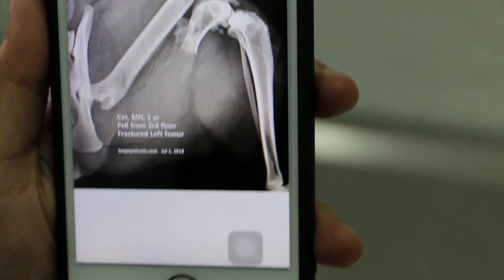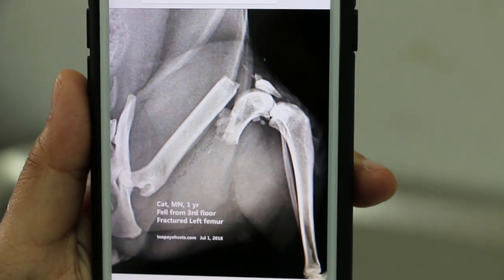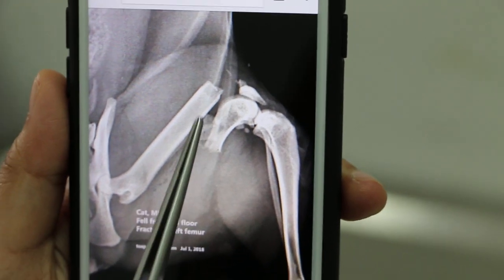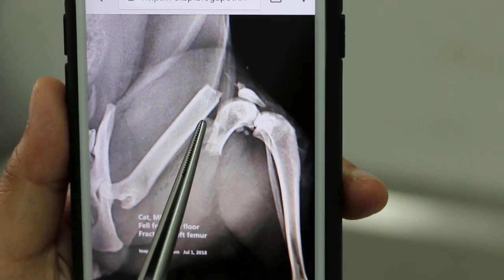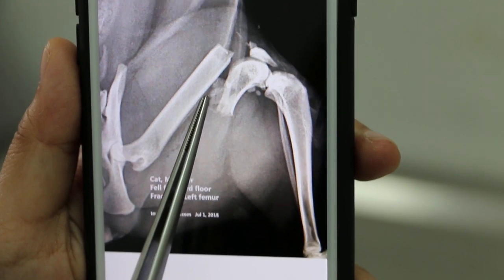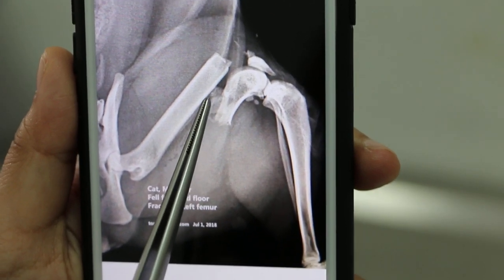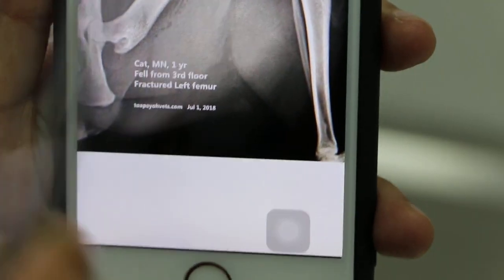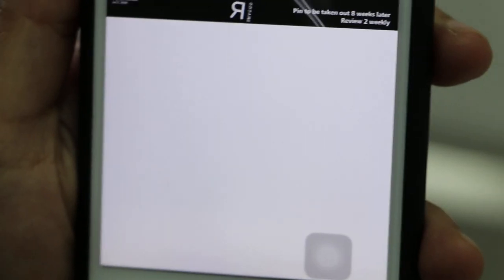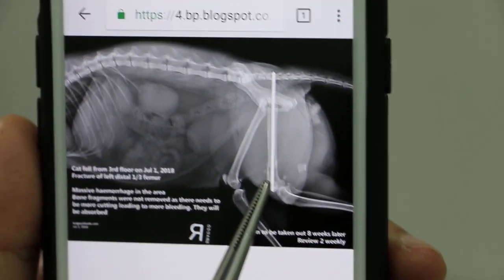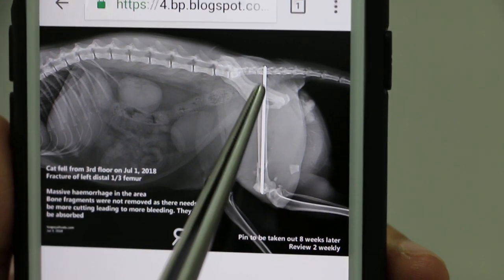Now we look at the ventral-dorsal view. You can see the fracture is a spiral fracture. There are some fragments lying around. We don't remove the fragments during surgery as they dissolve by themselves — removal would cause more bleeding. Now we look at the third x-ray, which shows that the pin was inserted 8 days ago.